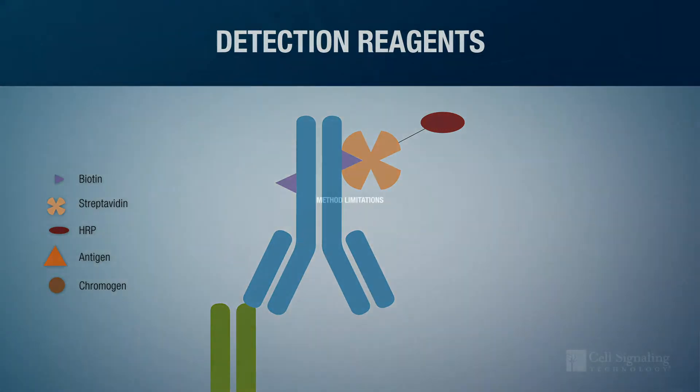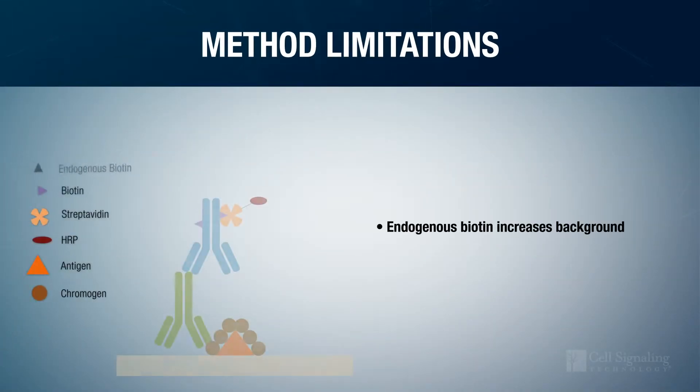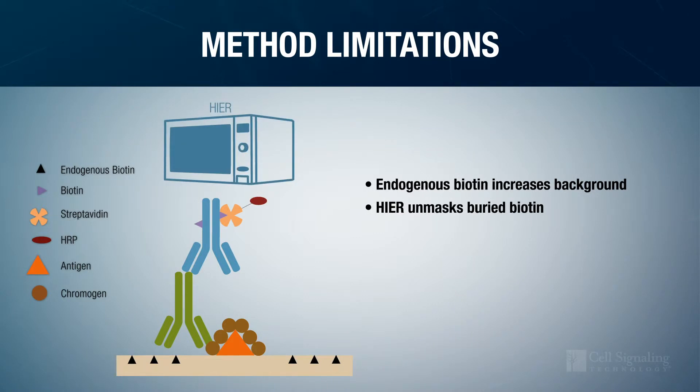This method has several limitations. First, the streptavidin-HRP complex can bind to endogenous biotin and produce significant background signal. Endogenous biotin can be exacerbated if heat-induced epitope retrieval is used, as buried biotin is unmasked alongside other epitopes.